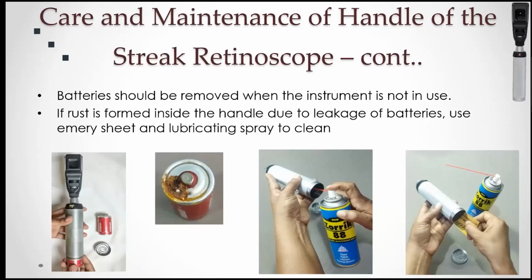And at the end of the day, after usage, we should remove the batteries from the handle. If you leave the batteries inside for a long time, then it may leak. So the handle inside and the rheostat get rusted and corroded by the leakage of the batteries.